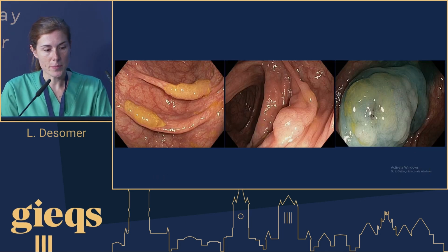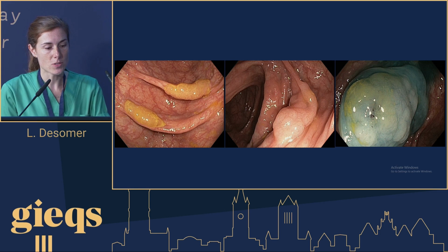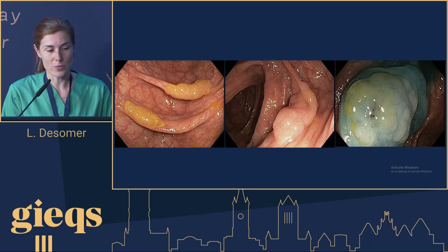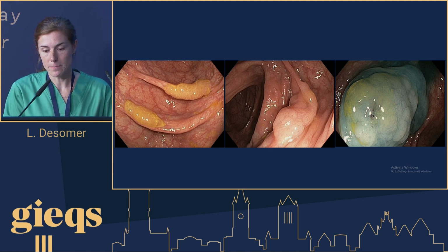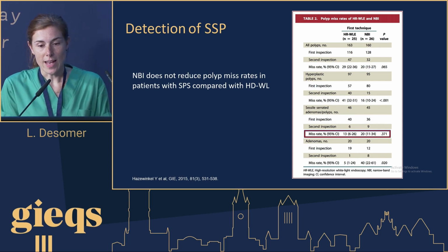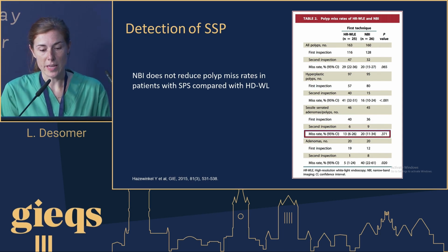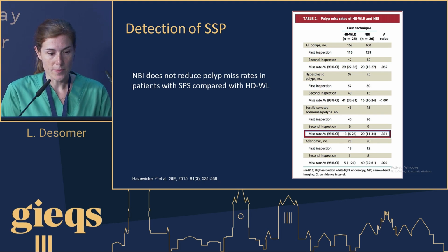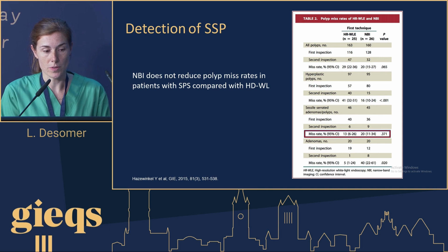These are some nice examples. You see on the left side what I meant with stool adheres to it. This is obviously a bit emphasized, but you can see this perfectly, just one lesion, just a little bit of stool, just always go and check. Now we need to detect them, and how can we improve our detection rate of SSPs? Well, obviously studies have been done comparing high definition white light and narrowband imaging. It doesn't reduce the polyp miss rates in patients with serrated polyposis syndrome.